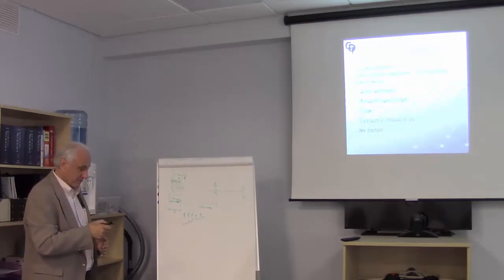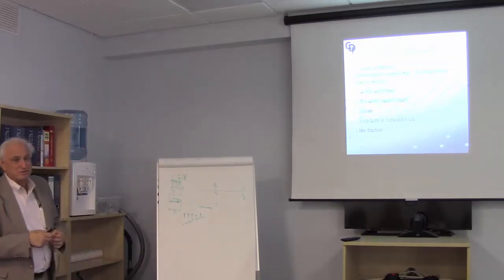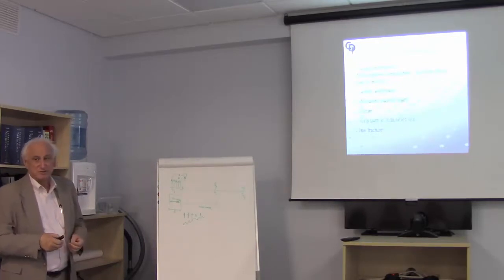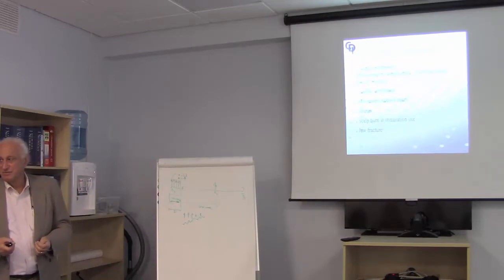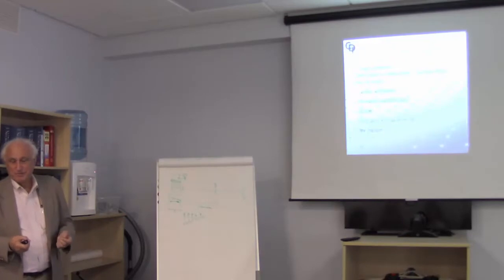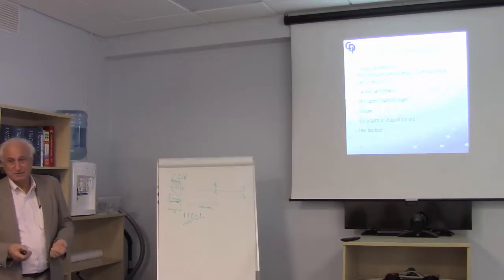Complications. Tongue lacerations. This is the most common complication secondary to transcranial motor stimulation. I assume everybody's done TC, transcranial motor potentials. If you look at the patient, they're not draped. It's like hitting their head with a hammer, repeatedly.